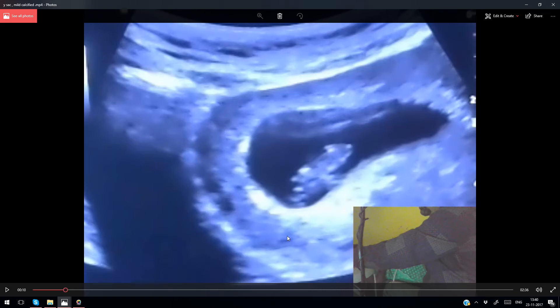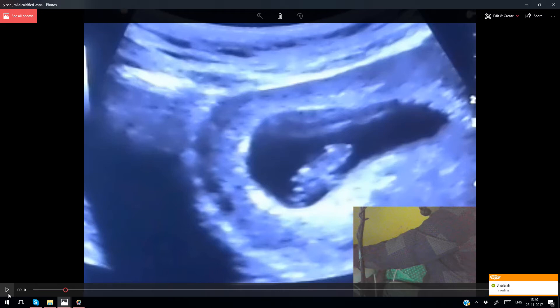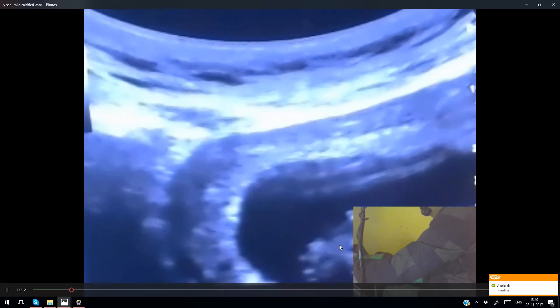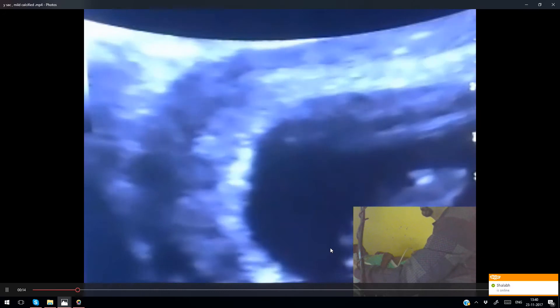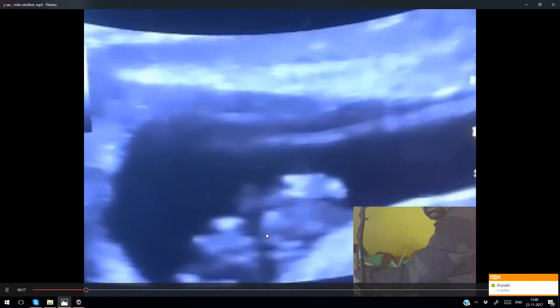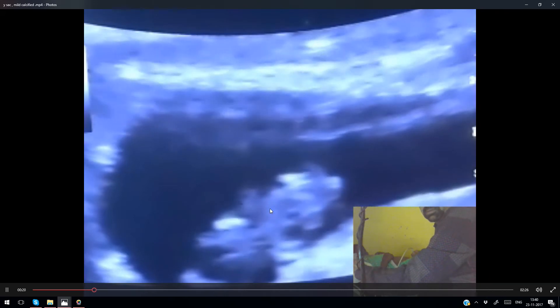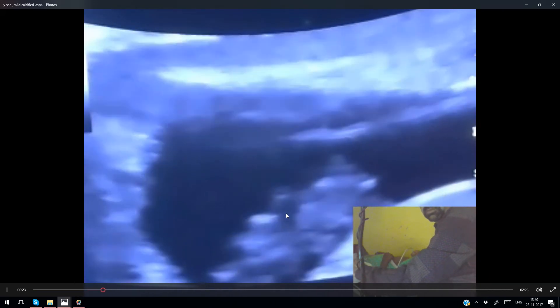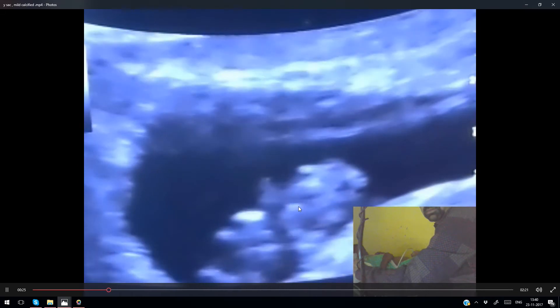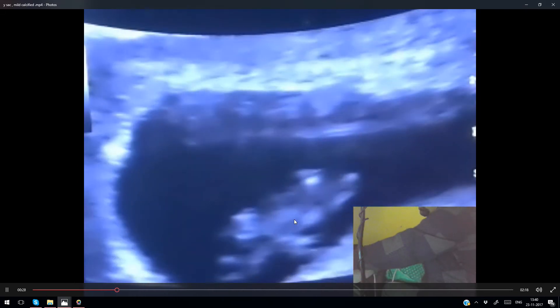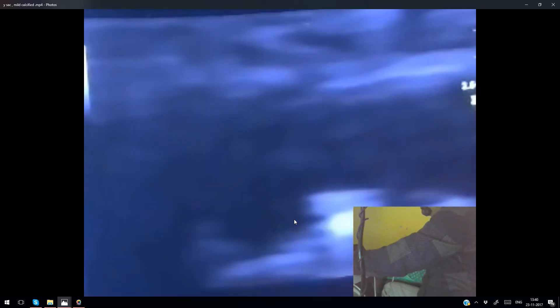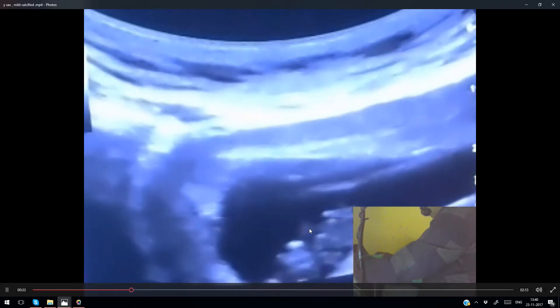We will show you some videos of the yolk sac — how it appears and when we can tell that the yolk sac is abnormal. Here is the fetal pole with cardiac pulsations. You can make out that the cardiac pulsations are there, but I will not be satisfied with the cardiac pulsations only. First, I will measure the fetal heart rate, then I have to correlate it with the CRL.